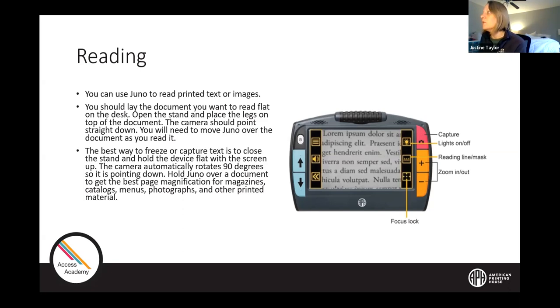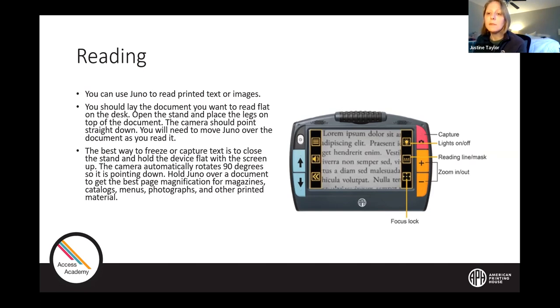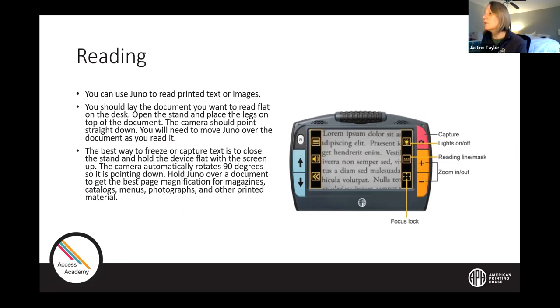Juno has physical buttons and touch screen menu buttons. When you capture an image, you can pinch to zoom on the screen to enlarge the text, zoom in and out, and use one finger to drag on the screen to pan the enlarged image. You can also change the color contrasts, just like you would on a normal handheld video magnifier.